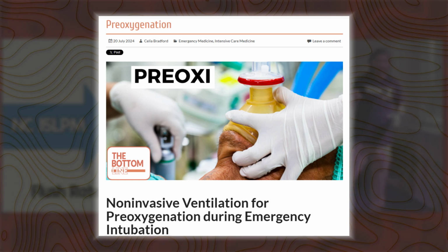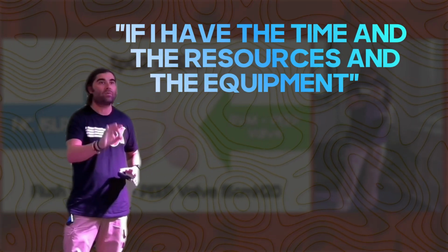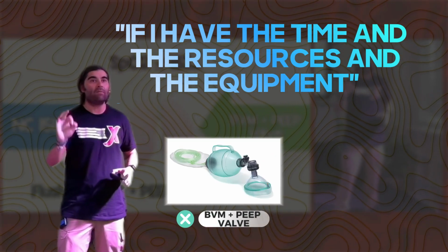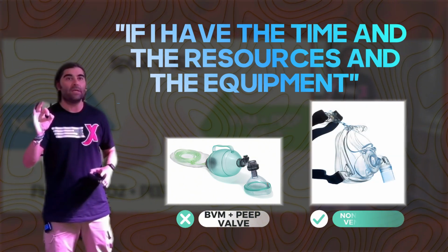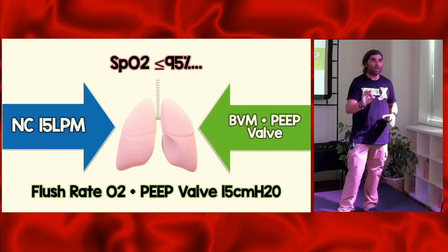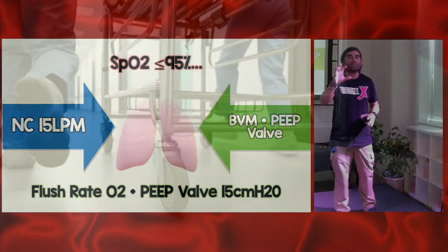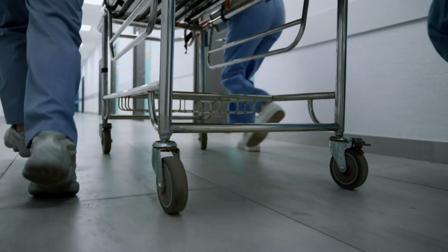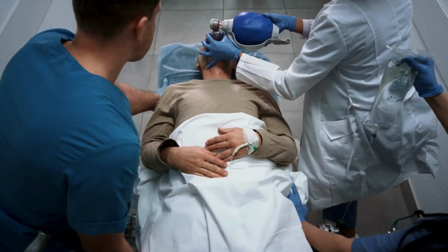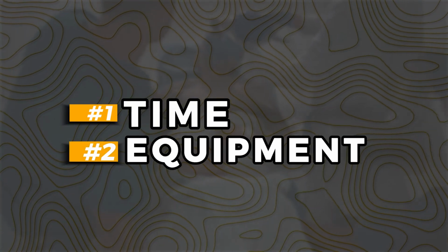And if I could add something to this slide, it would be that if I have the time and the resources and the equipment, instead of the bag valve mask and a PEEP valve, I would rather use non-invasive ventilation for my pre-oxygenation if I'm thinking shunt or dead space, okay? I don't have that on the slide because the study came out recently, and in some of the environments I work at, a lot of freestanding ERs, or if I'm responding to codes on the floor, sometimes I don't have the time or the equipment to use non-invasive ventilation.